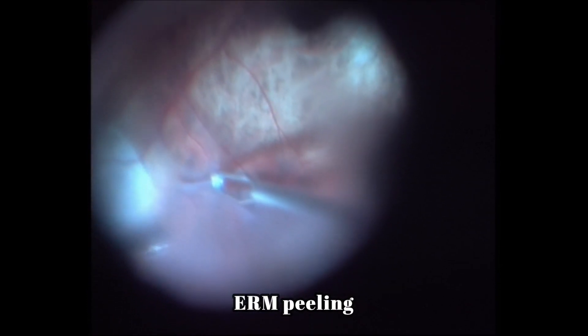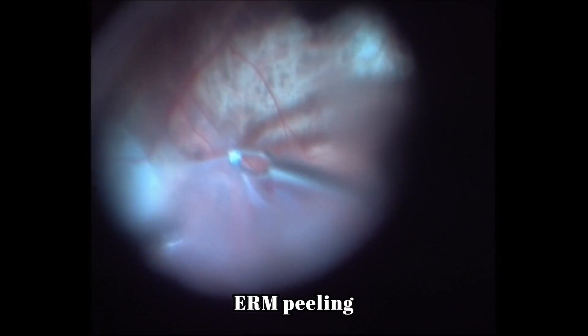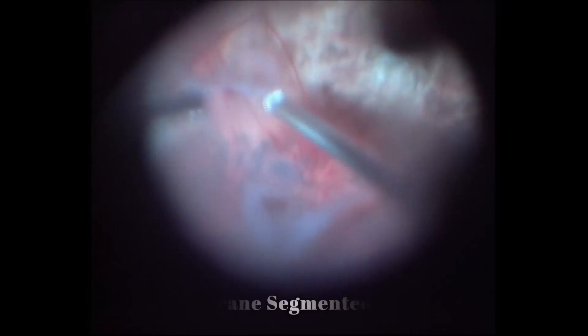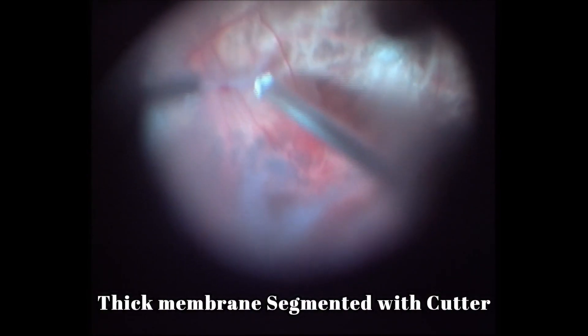which is gradually being removed. Myopic retinas are very thin and one has to be very careful while gradually removing these membranes.